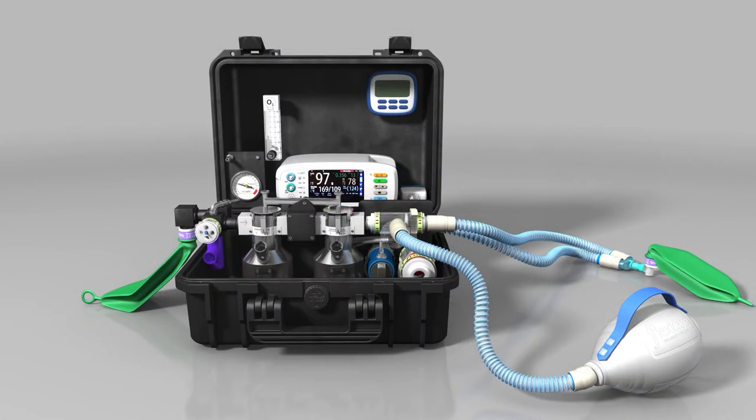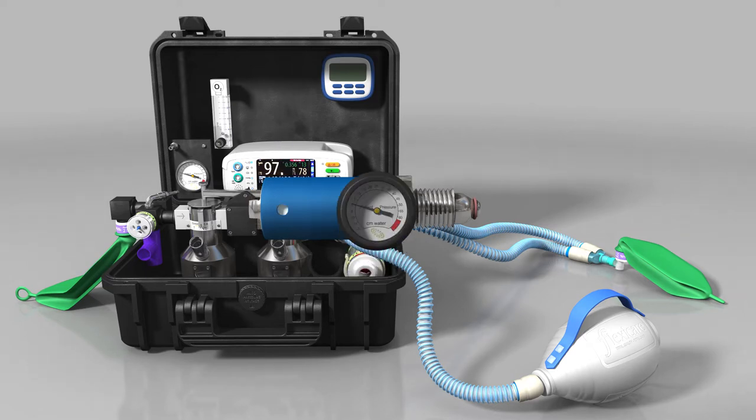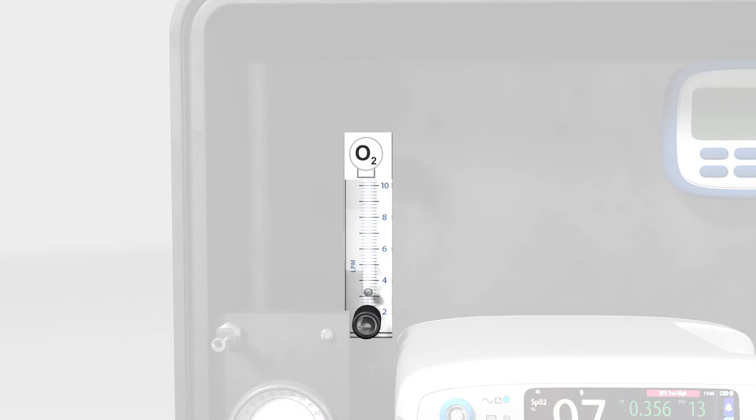Supplementary oxygen can be added to the system either from an oxygen concentrator or from an oxygen cylinder using the regulator supplied. If using cylinders, use the regulator gauge to determine when the cylinder is nearly empty and needs changing. There is an oxygen flow meter fitted to regulate the flow. As the gas flow rate increases, the float is carried further up the tube, indicating the flow rate.